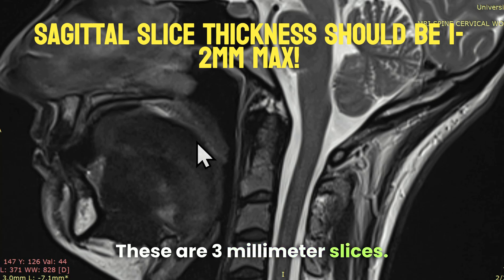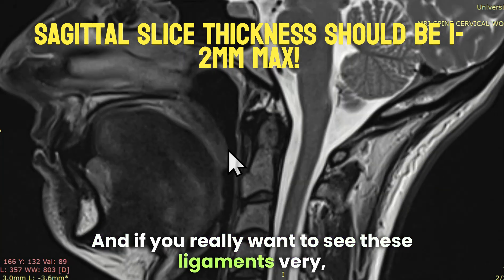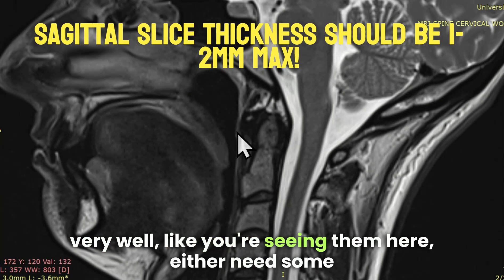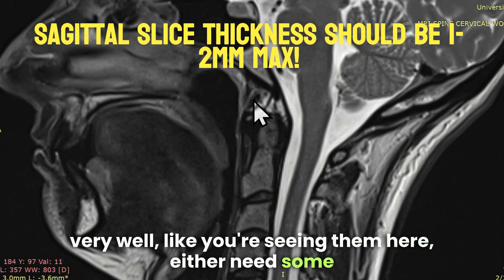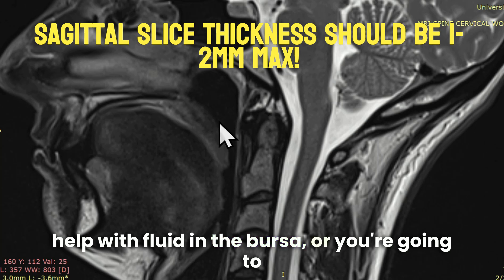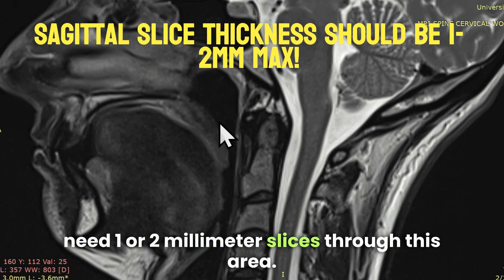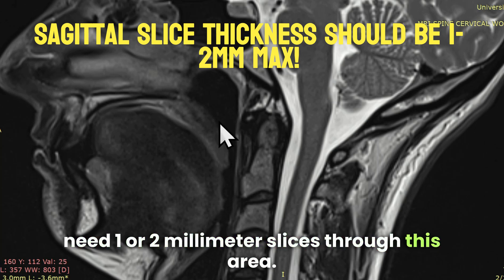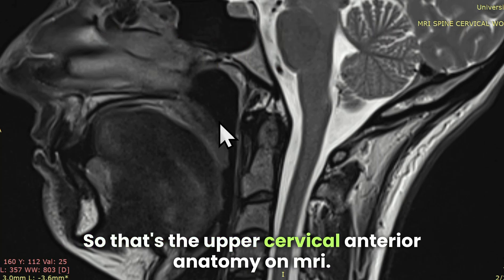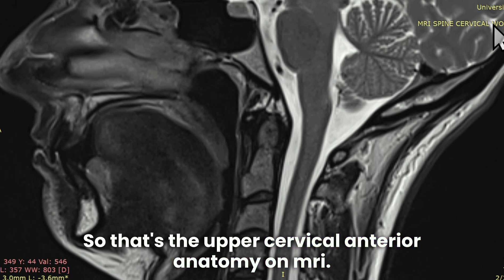These are three millimeter slices, and if you really want to see these ligaments very well like you're seeing them here, you either need some help with fluid in the bursa, or you're going to need one or two millimeter slices through this area. So that's the upper cervical anterior anatomy on MRI.